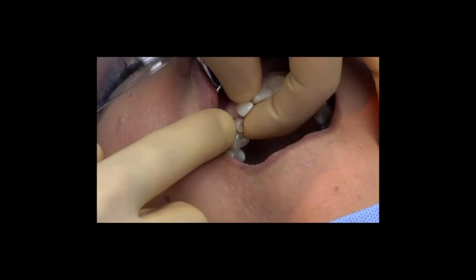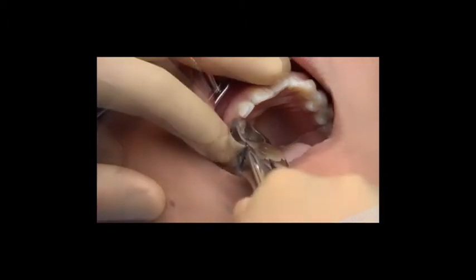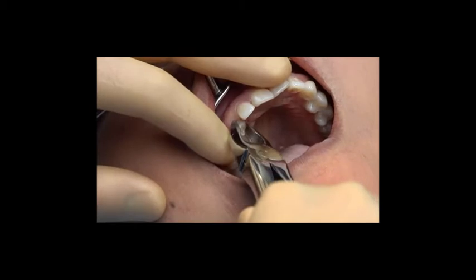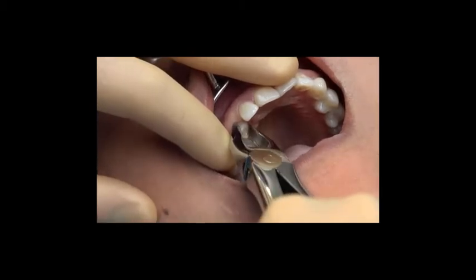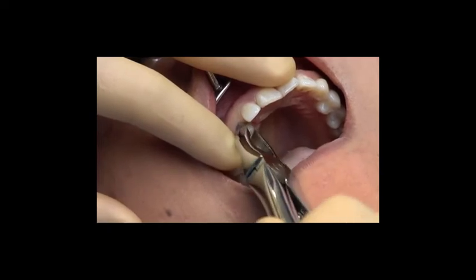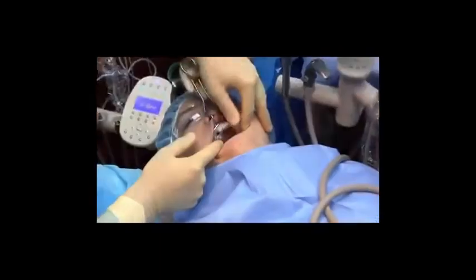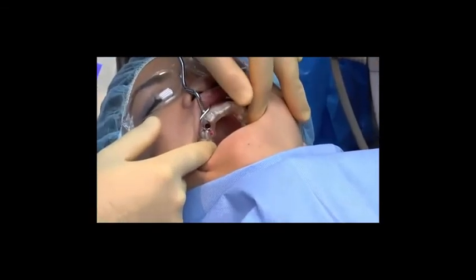And here's basically the line started, the IV line to draw blood for PRF. Now the extraction of this tooth is obviously not too difficult. This is a retained baby tooth with a short root, but I typically like to use these apical retention forceps that can be purchased from Carl Schumacher. There are several other companies too. They engage the roots deeper and still try to extract this tooth with very minimal trauma.